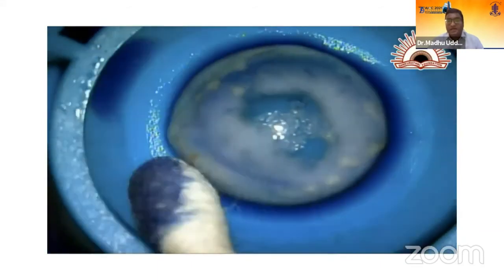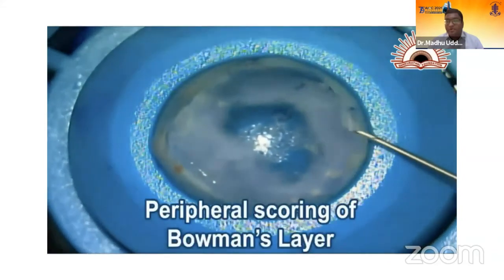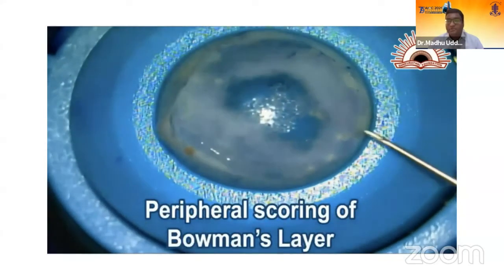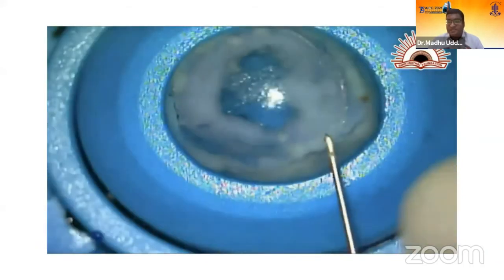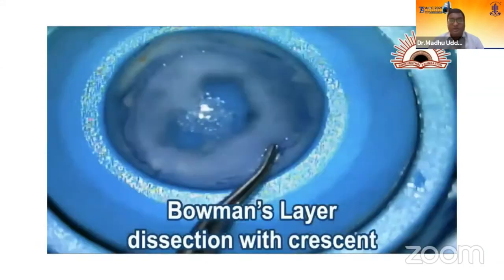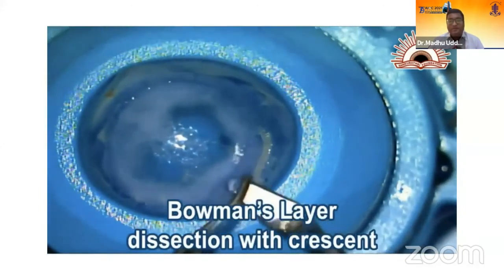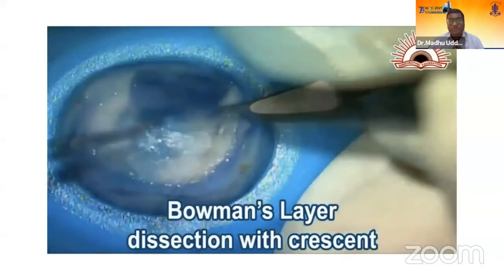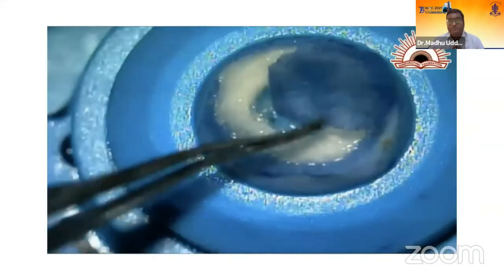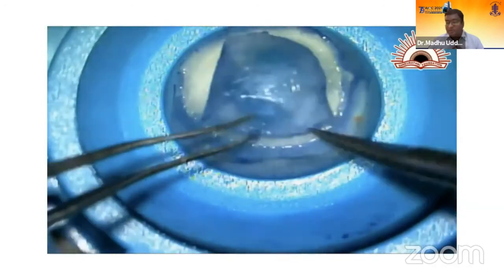Once the dyeing is done, with the help of a 26 gauge needle, like you do your can opener, you do a peripheral scoring of the Bowman's layer, which is restricted to 7.5 or 8 millimeters. And then you take your regular crescent and dissect it in the plane you want. So that finishes the donor part of the surgery.